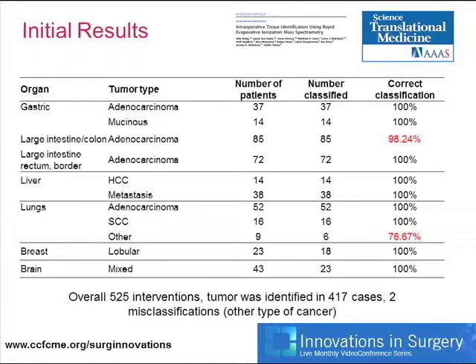And what we did was we looked across a large number of different tissue types, because we want to see the performance of the device. And we got a pretty good degree of classification. And that inspired us to take this on and to try and do high-quality prospective work to see if we could repeat this in better constructed randomized controlled trials, and that's what we're doing.